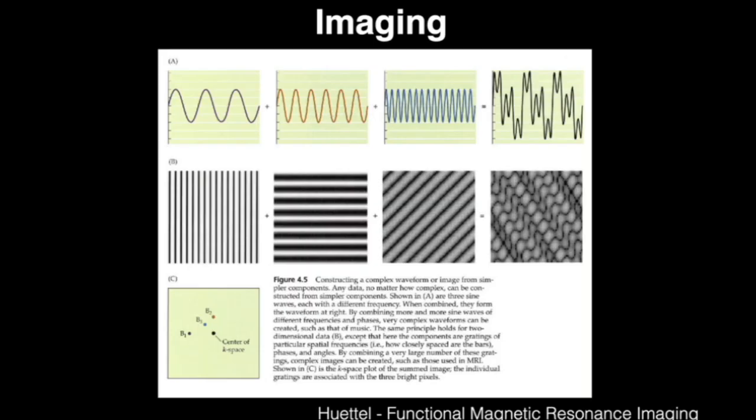When I was first doing this, it took me a long time to wrap my head around this. One thing that finally helped this make sense to me was the fact that Fourier analysis starts off with the theory that you can create any waveform from adding up a set of regularly varying signals. So if you have a large number of sines and cosines, if you weight each of those appropriately, you can reconstruct any time signal.